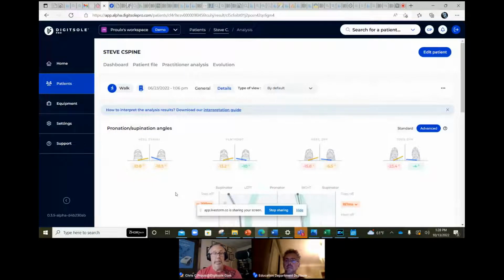So we did this analysis, and I discussed it with the patient briefly, and then we decided to perform some treatment. We did radial pressure wave along the paraspinals and his cervical spine. His cervical spine injury was at approximately C5.